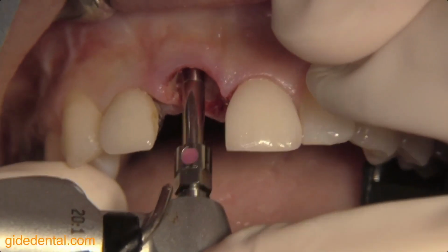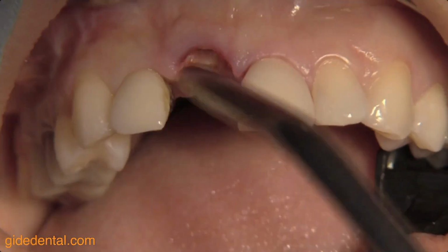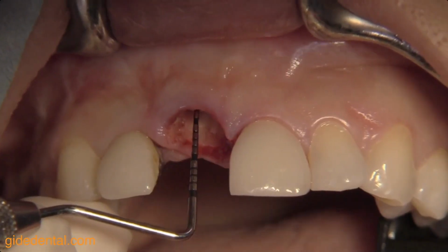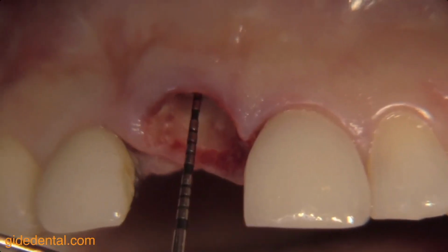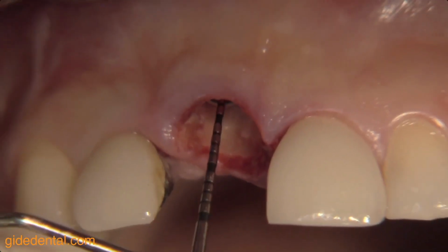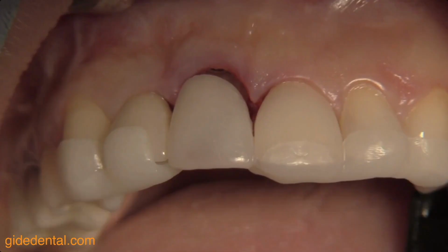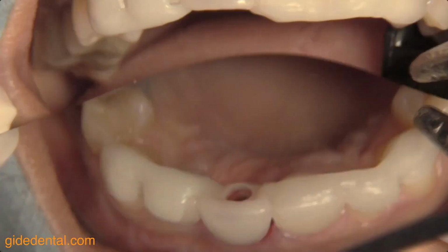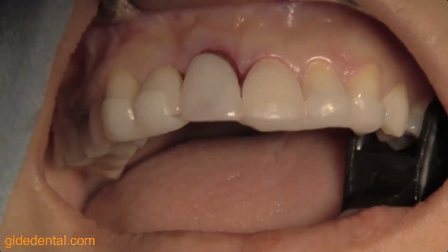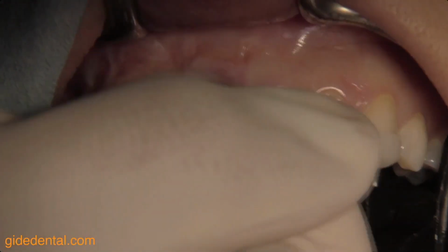I'm slowly torquing it into position, holding it really in place. I don't want this to be somehow going in the wrong direction, because implants sometimes, when they have minimal bone, they can look for the path of least resistance. So I really have to use some careful evaluation. I'm checking here that there's enough open space between the implant and the buccal bone. Checking again with the surgical guide that this is properly following the tooth position, and it is.